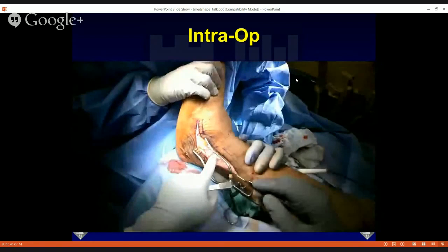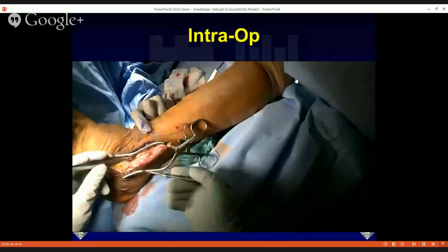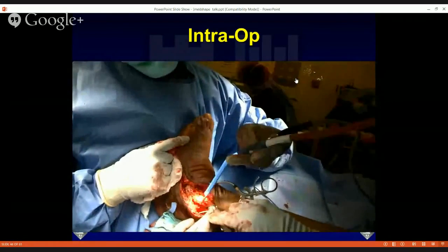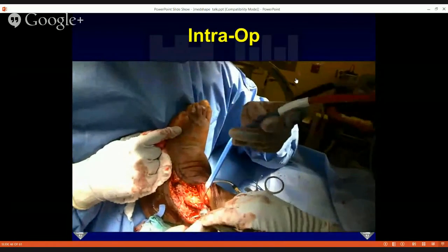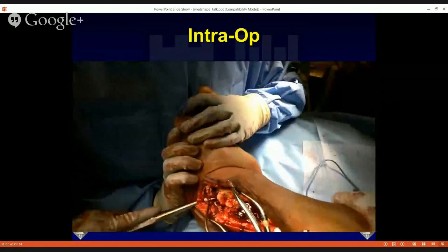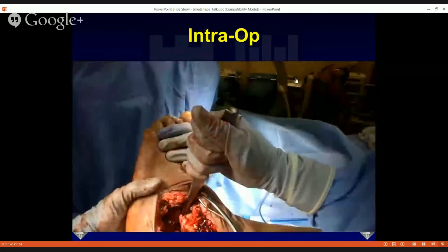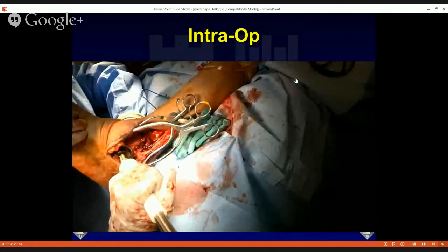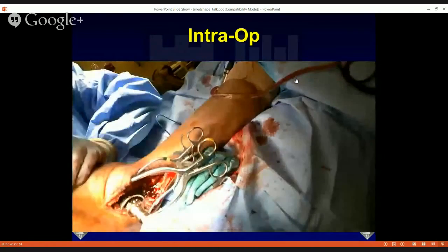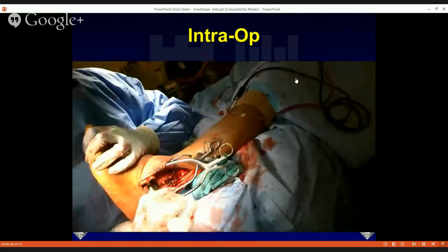I decided to approach this laterally to best access both the ankle and subtalar joints, do the fibular osteotomy, and harvest the distal fibula to use as autograft. Once I started prying through the ankle, I realized how dislocated and resorbed the talus was — and I eventually had to morselize the remaining talus. I then took acetabular reamers and sequentially reamed the distal tibia and superior calcaneus to make room for a femoral head allograft from our bone bank — a 48mm allograft, requiring reaming to at least 47mm.